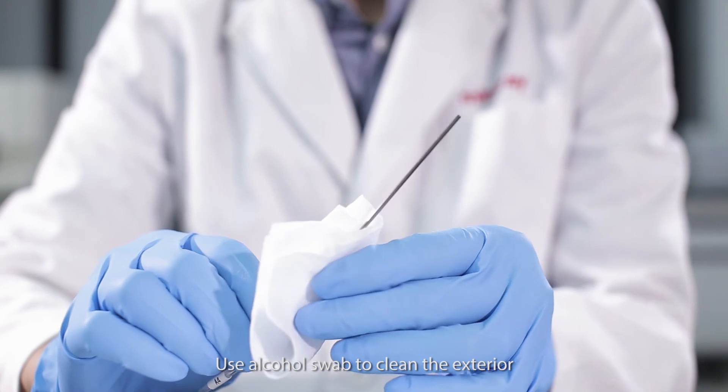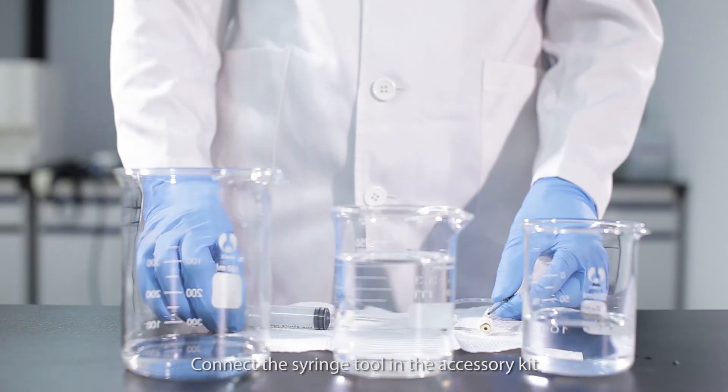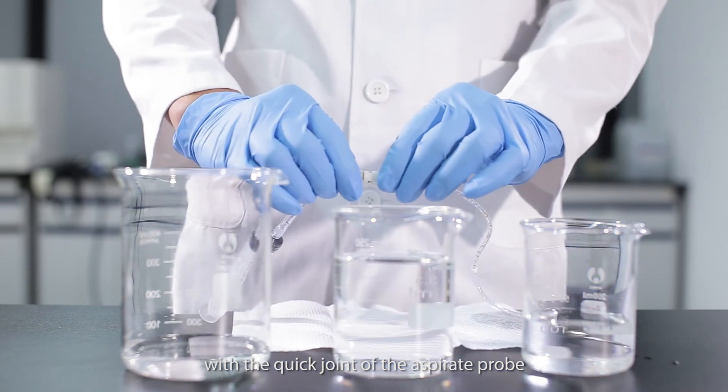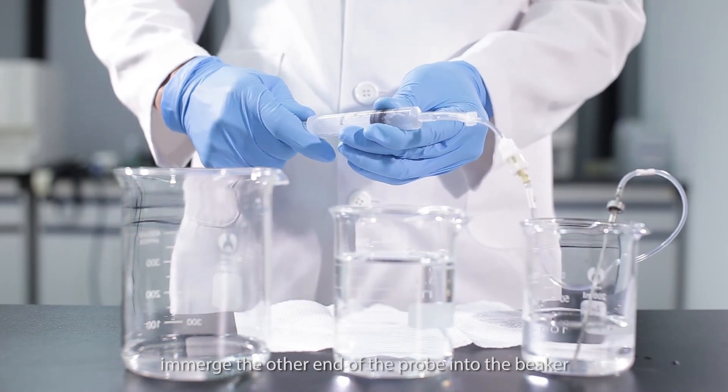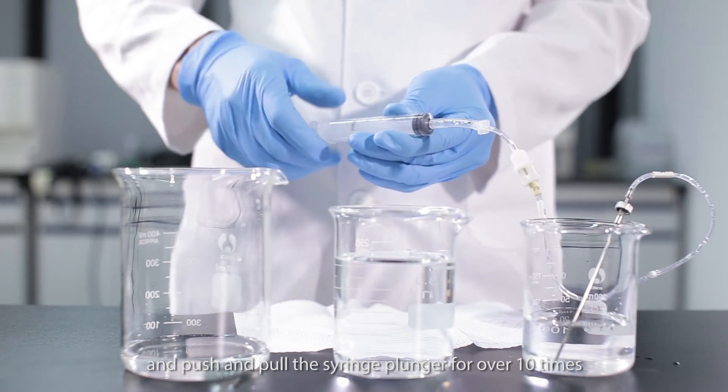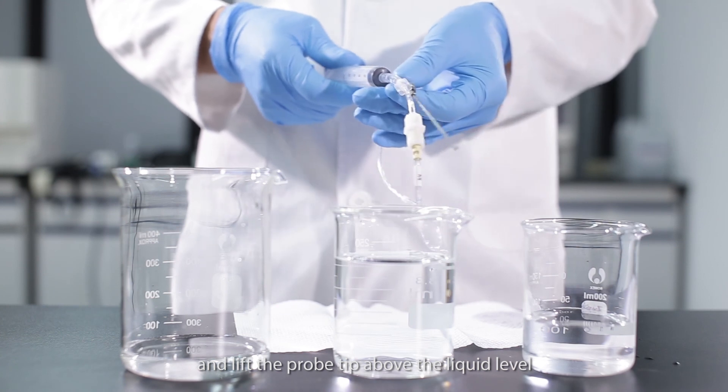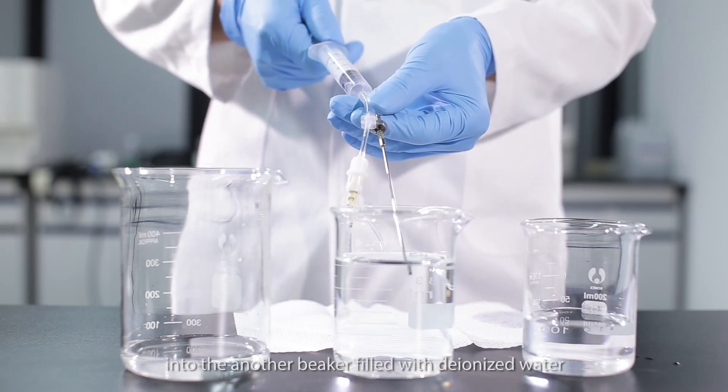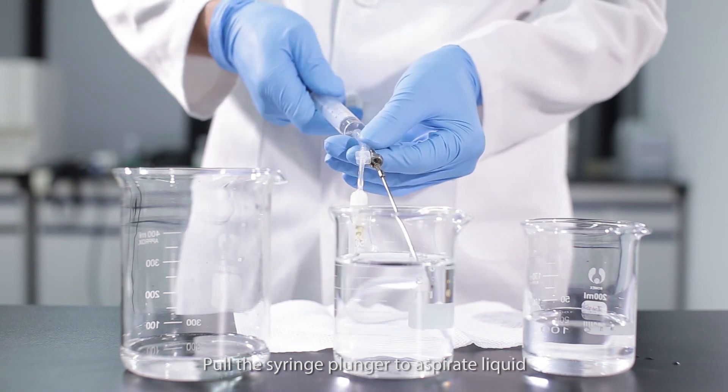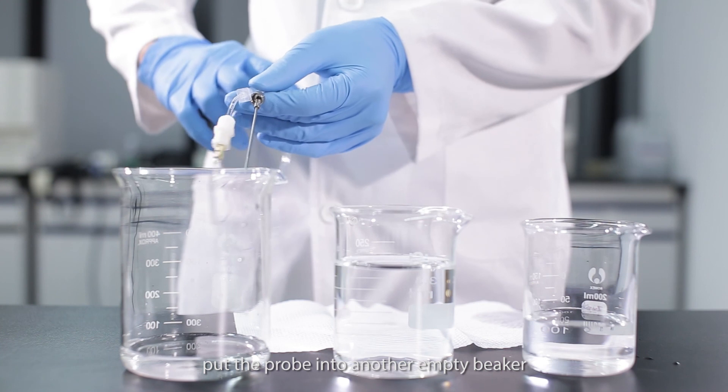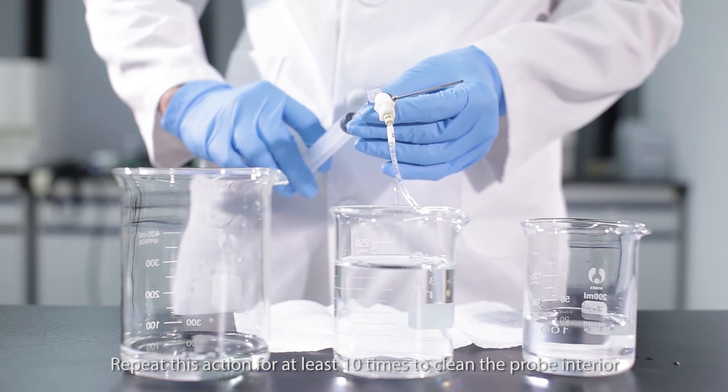Use alcohol swab to clean the exterior of the replaced aspirate probe and use the unclogging device to clean its interior. Connect the syringe tool in the accessory kit with a quick joint of the aspirate probe. Prepare a beaker full of CD80 wash solution. Emerge the other end of the probe into the beaker and push and pull the syringe plunger for over 10 times. Discharge the liquid in the tube and lift the probe tip above the liquid level. Emerge the probe tip into another beaker filled with deionized water or distilled water. Pull the syringe plunger to aspirate liquid. Put the probe into another empty beaker and push the syringe plunger to discharge the liquid. Repeat this action for at least 10 times to clean the probe interior.